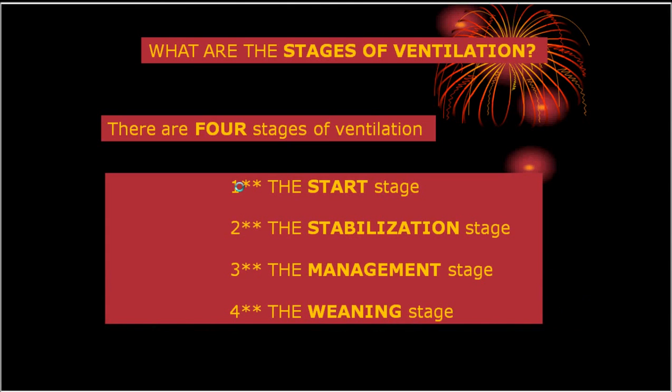Ventilation is a bridge. It is a bridge. It is not meant to be stuck to the patients. What are the stages before? I think it's better to discuss this classification.